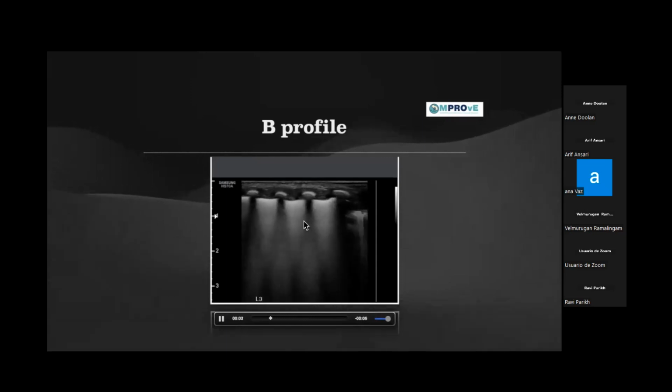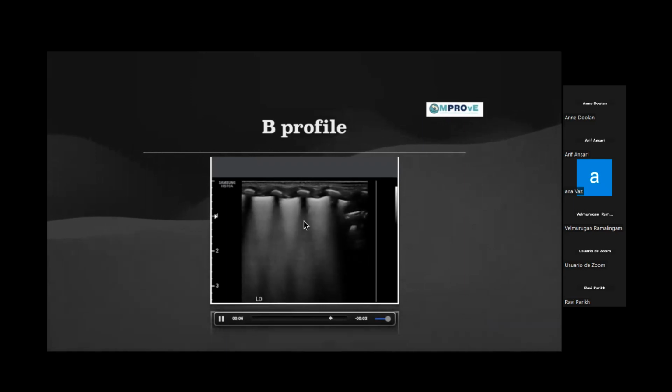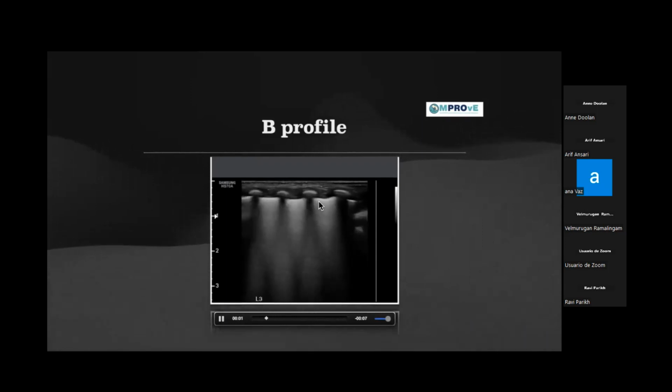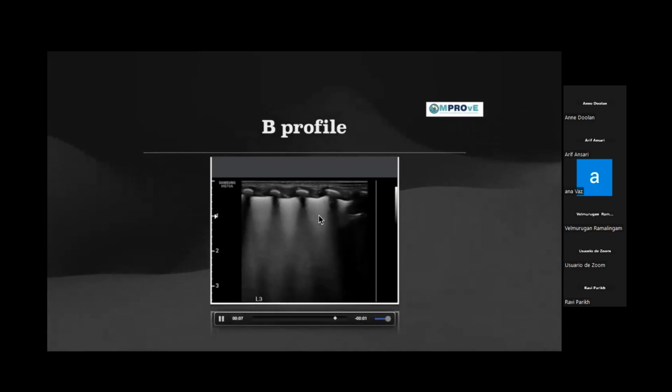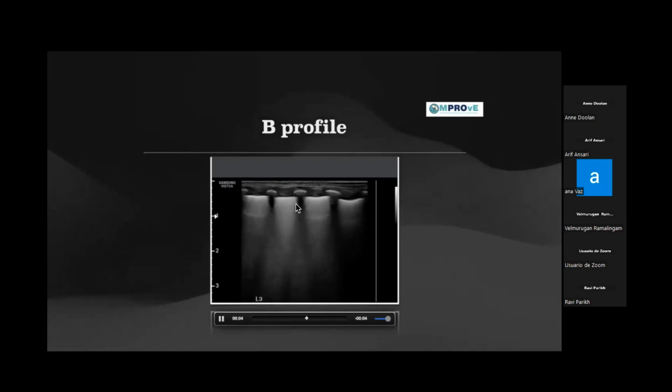So we are bang on top, 90-degree angle with the pleural lines. So there is no question that if I'm going to move, we would have seen better A lines or less of B lines and all that. So we are seeing what we are seeing, and we're going to interpret this image. Can I see the pleural line? Does anybody want to come in on that? Okay, so the next question is, do I see the pleural line? Well, you can say, I can see some brightness to begin with, but I cannot see a discrete, regular pleural line. That's how you can describe this image.